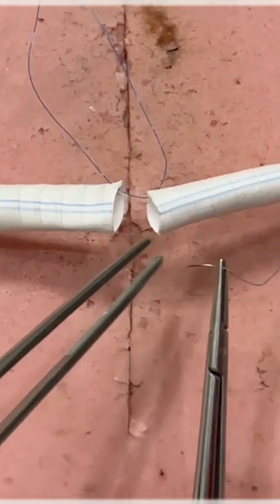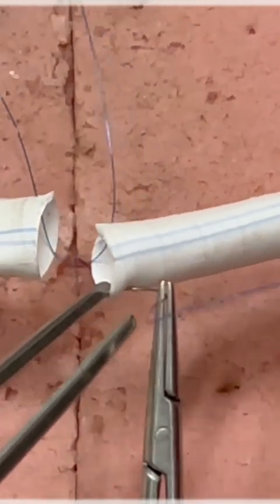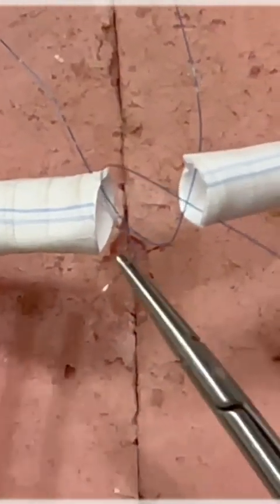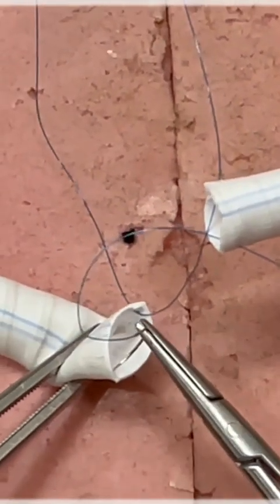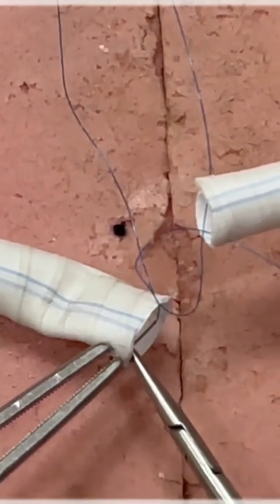The marking of the arterial wall, the anterior arterial wall, we have already done. So now I'm taking the 6 o'clock, the end towards the surgeon. Here I'm coming outside in on the proximal or afferent loop, and inside out on the efferent loop. The aim is to keep the knots outside the vessel lumen, and here, just to save the suture, I'm taking it.